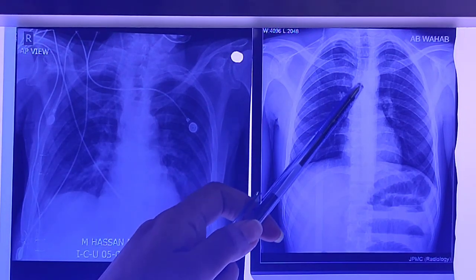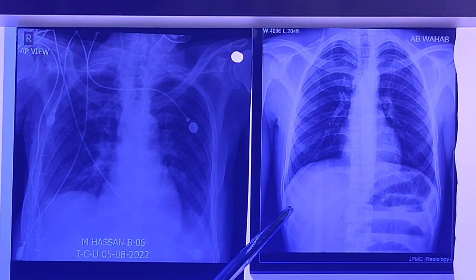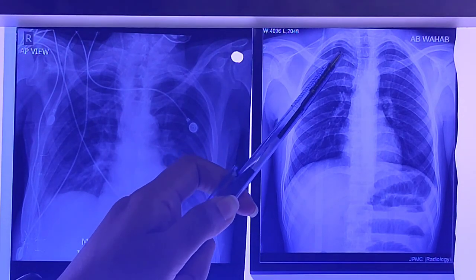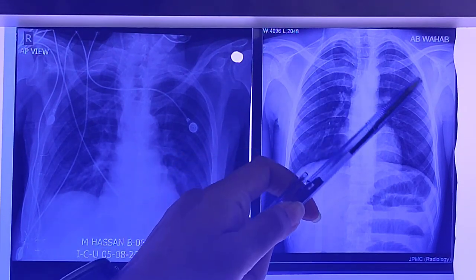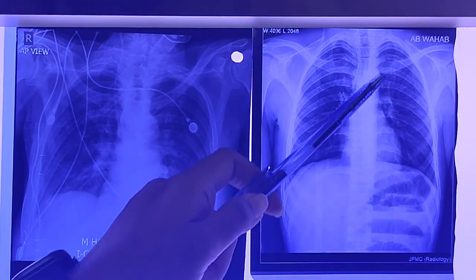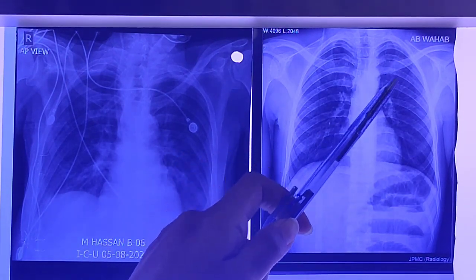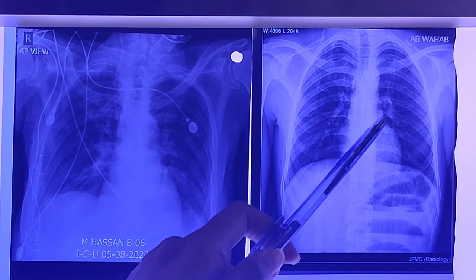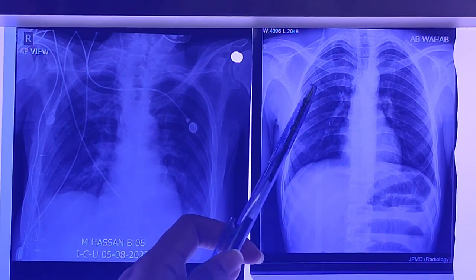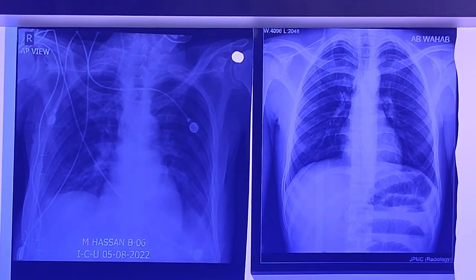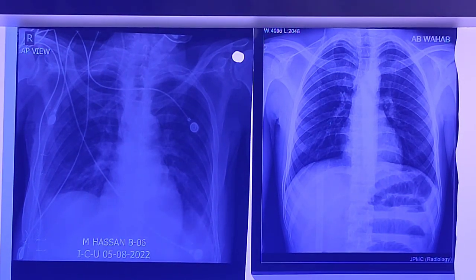While in the PA view you can clearly see the lung field of the patient and you can clearly differentiate where the alveolar markings are. So this was the differentiating point between the AP and the PA view.